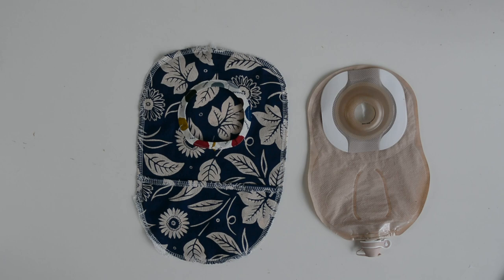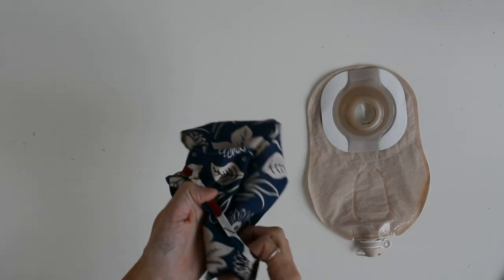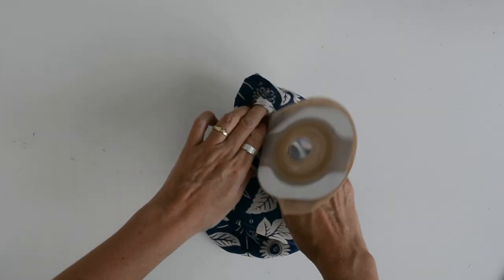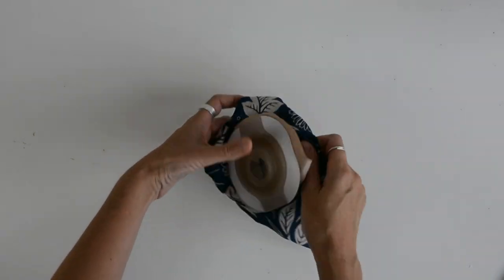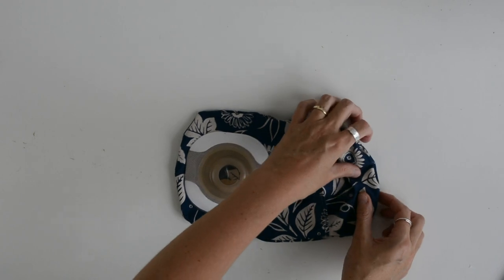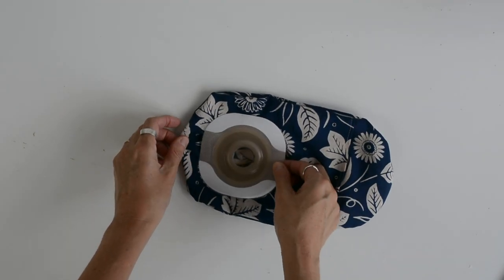So here we have it - one finished bag. This is the wrong side, I'm going to turn it the right side out. Then check that the actual ostomy bag itself fits inside the cover I've made for it. So you can see how the circle is important.